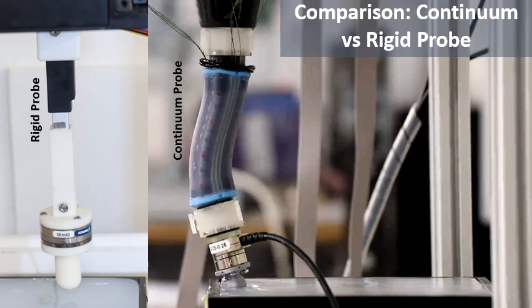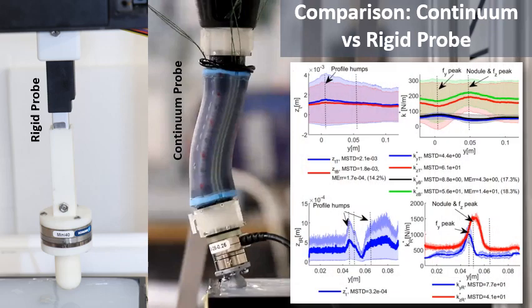We also compare a rigid probe against our continuum probe. Here are the results. On the top, you see the results for the continuum probe, and on the bottom, you see the results for the rigid probe. On the left is the estimated profile, and on the right, the estimated stiffness.